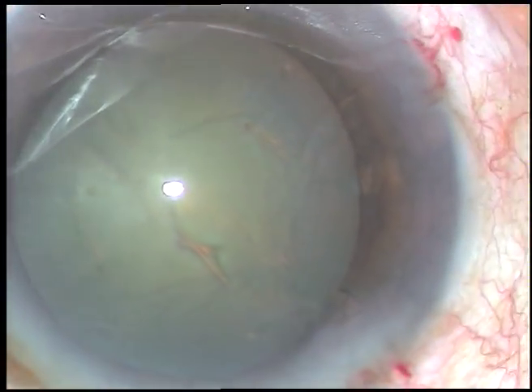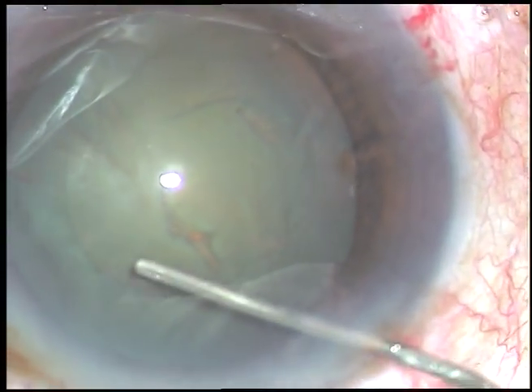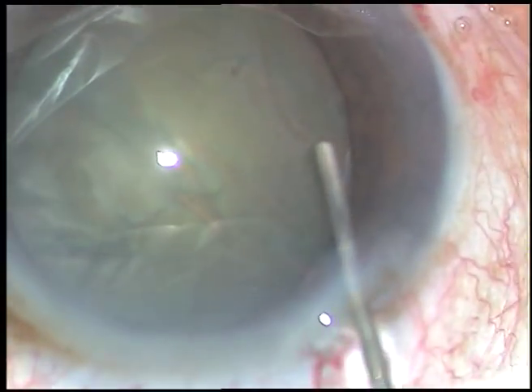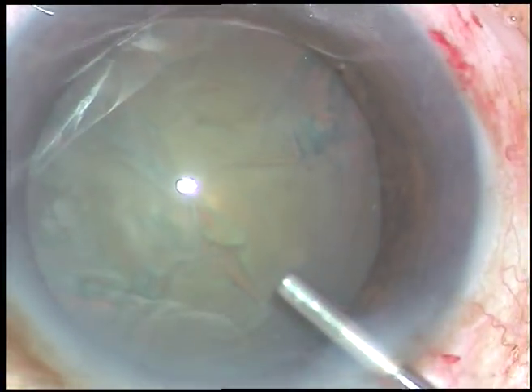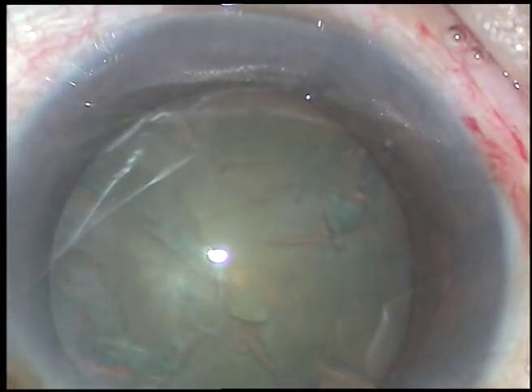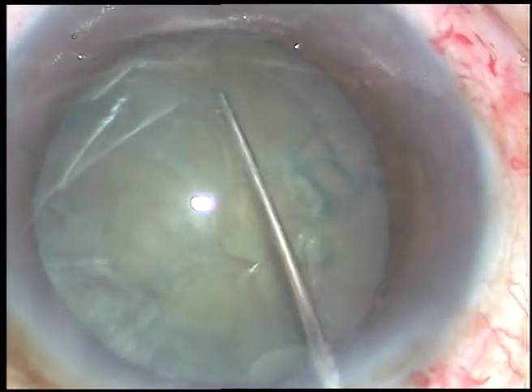It is about 4.5 mm rexis. Though it is small, I was quite confident and sure that I will be able to manage the nucleus. So, I will do in-the-bag phacoemulsification and the nucleus will be nicely managed. So, I did hydro-dissection and the nucleus is mobilized.